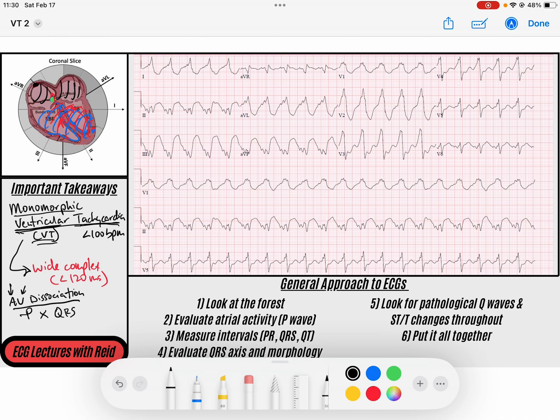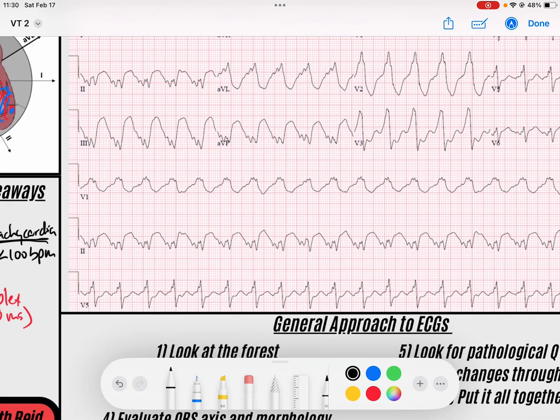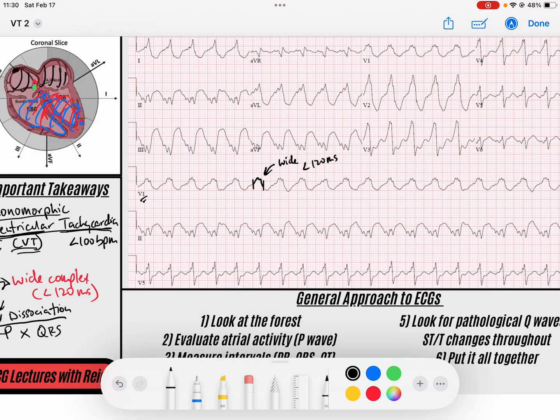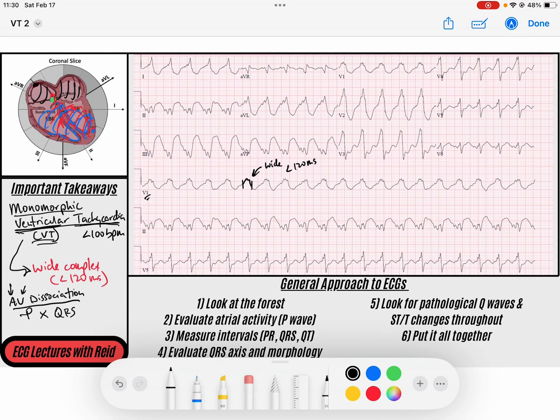Looking at this ECG, in the V1 rhythm strip we've got a QRS that is really slurry and wide complex — greater than three little boxes, or greater than 120 milliseconds. Another feature of monomorphic VTAC is that it's going to be regular. Notice it is very, very regular.